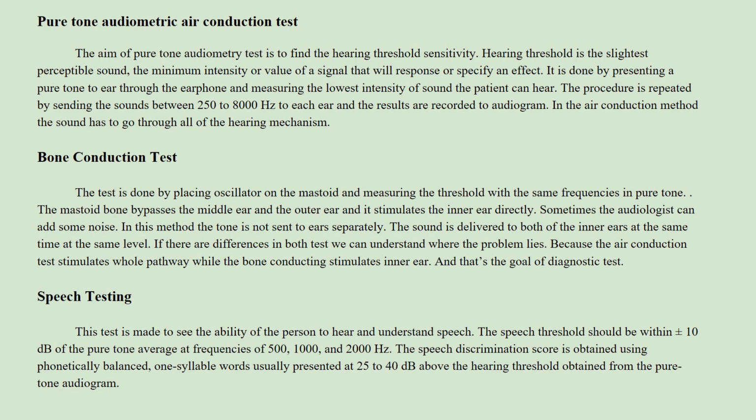Now we can summarize the variety of tests that can be done in the clinical audiometer. First, I will explain the pure tone audiometric air conduction test. The aim of pure tone audiometry is to find the hearing threshold sensitivity. What do we mean by pure tone sound? Pure tones are single frequency sinusoidal wave sounds.